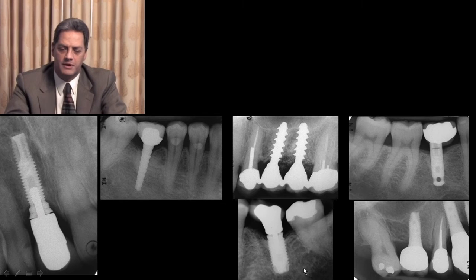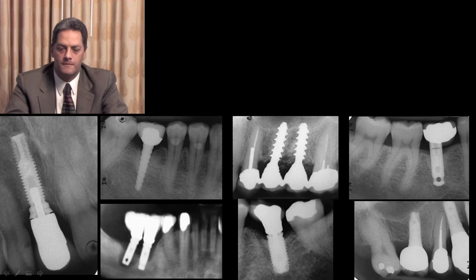Or sometimes we had restorations where the screw had some loosening, or the restoration was cemented prior to achieving proper seating of that final restoration. In this particular situation, we have bone loss that is quite advanced, very close to the nerve. So we need to visualize how this is going to be handled in a systematic way to obtain predictable results.